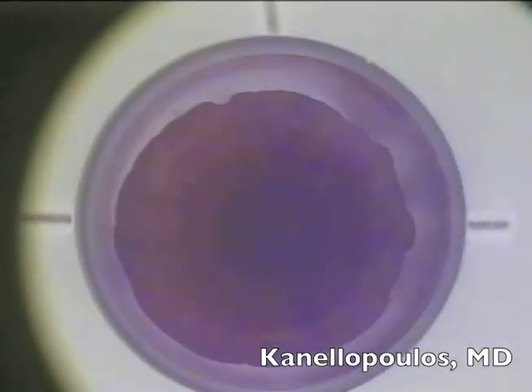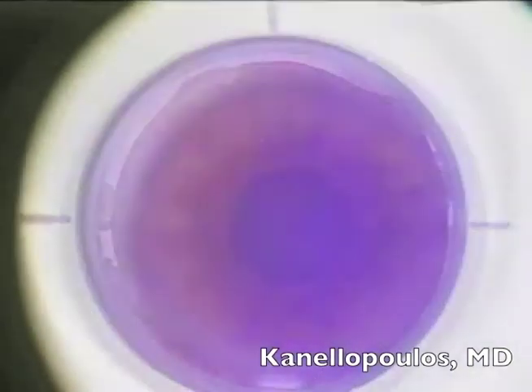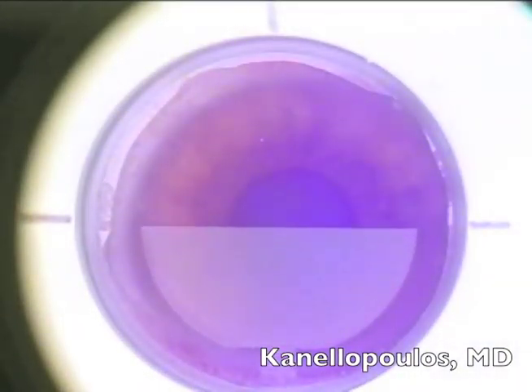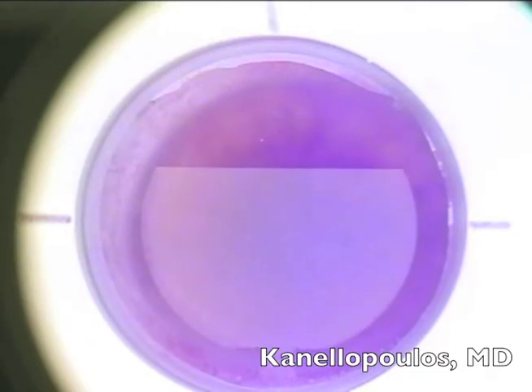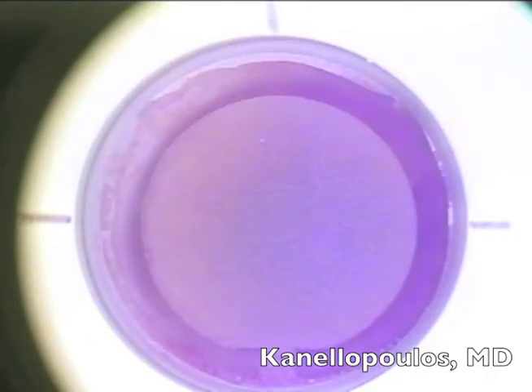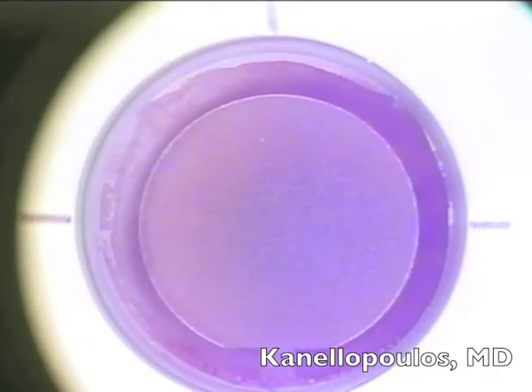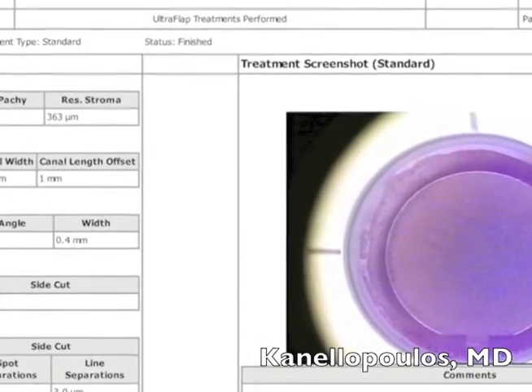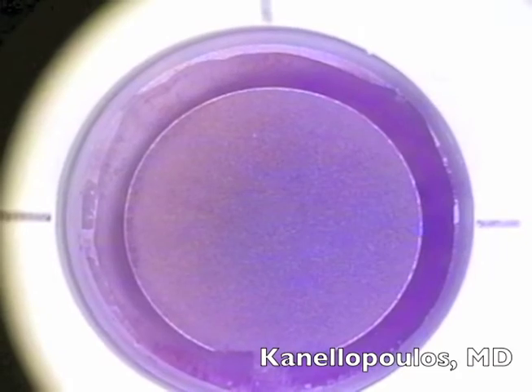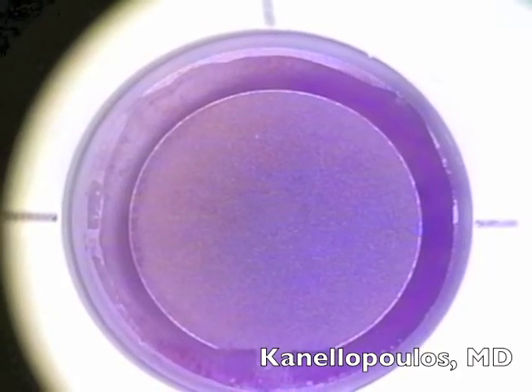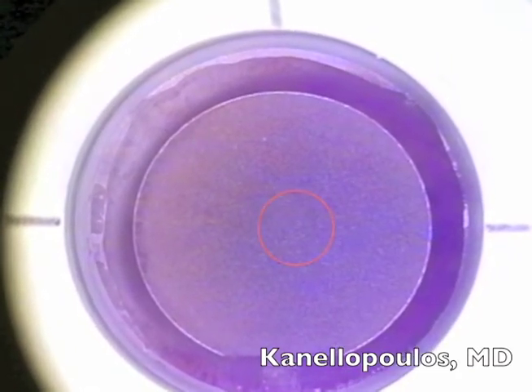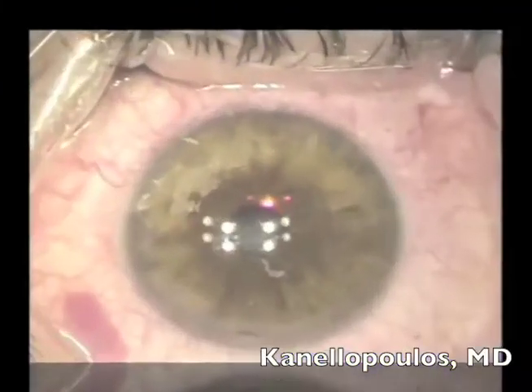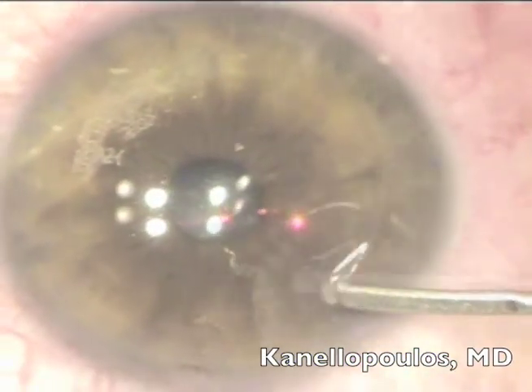Suction goes on right now at the moment the FS200 patient interface touches the cornea. Please note compared to the pupil how the ablation center is to the left, which is nasal. You can also see here on the report from the FS200 the actual femto flap, and how the flap is decentered nasally to match our topography-guided treatment.